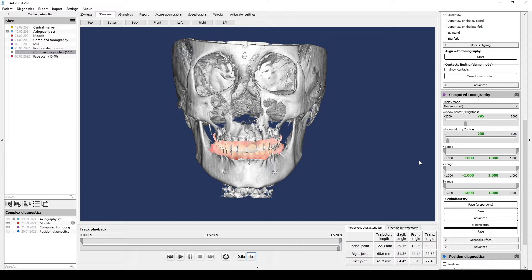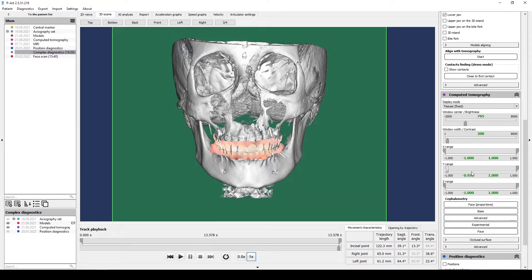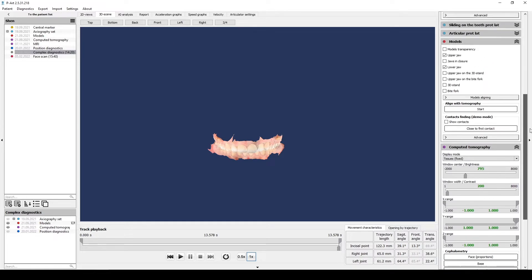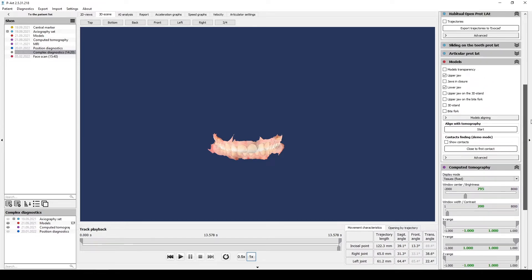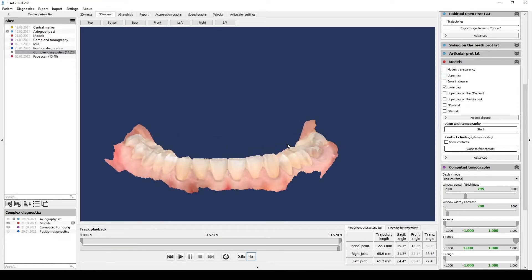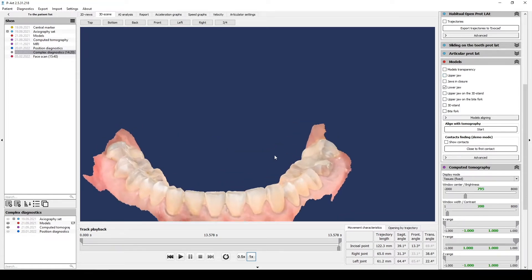We hide CBCT. Remove upper jaw in the section and put three points on the lower jaw dentition.